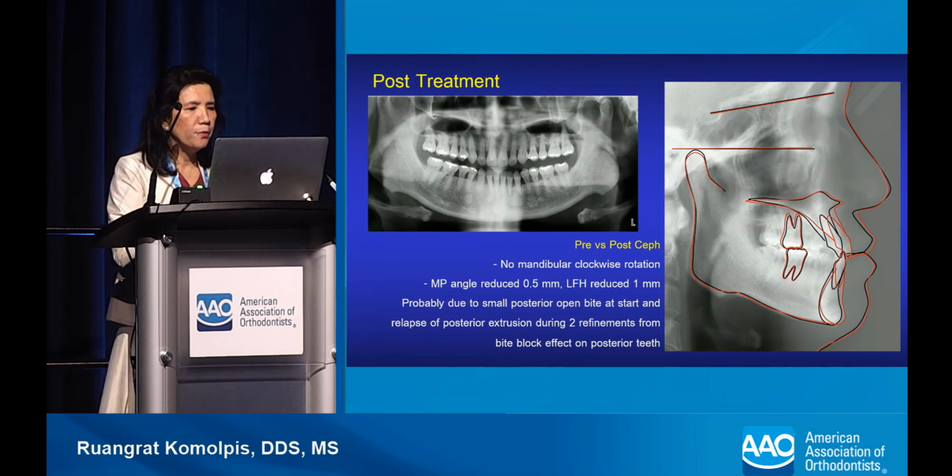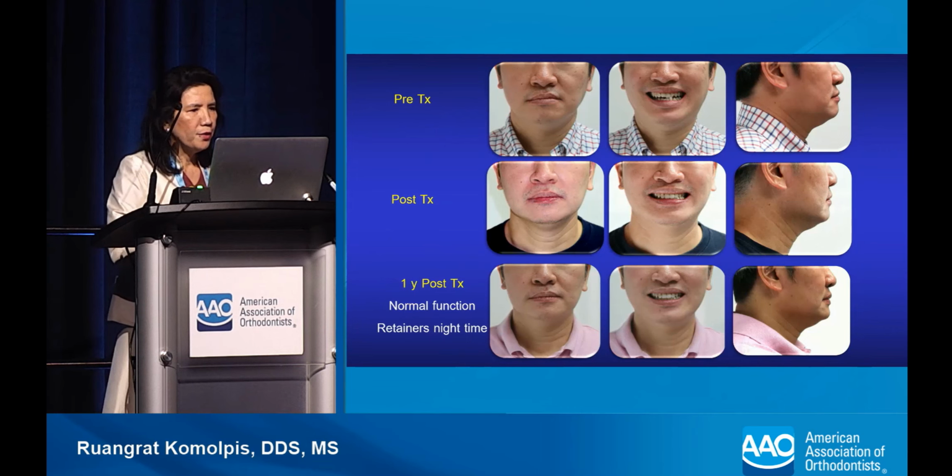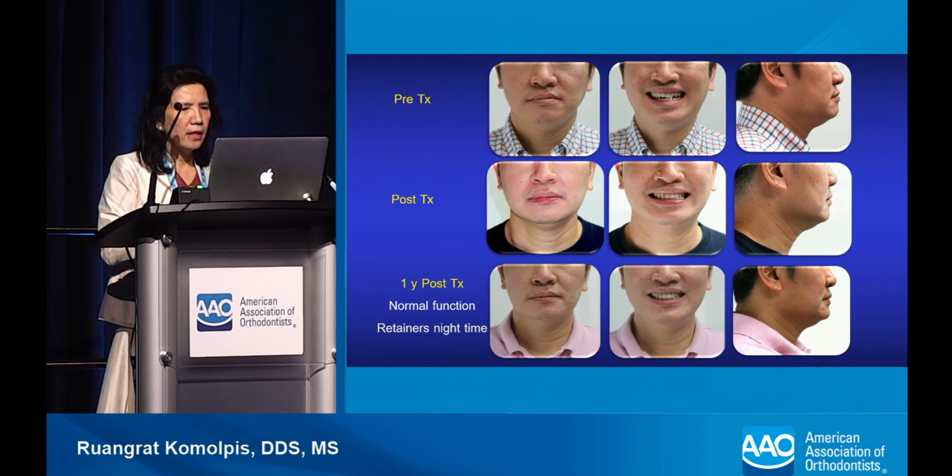I think this is probably due to the small posterior open bite at start, and also we have some relapse of the posterior extrusion during the two refinements from the bite block effect of the aligners on posterior teeth. This is his bite pre-treatment, post-treatment, and 1 year post-treatment. His facial changes, pre-treatment, post-treatment, and 1 year post-treatment, with normal function and retainer just at night. I think he has much improved facial profile.